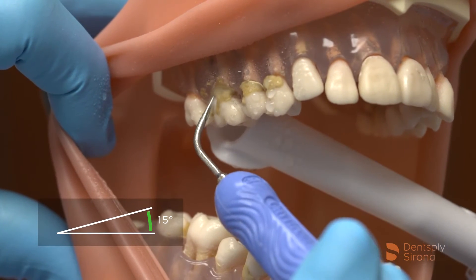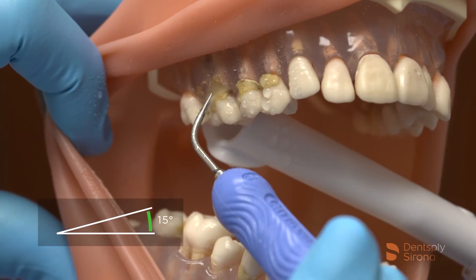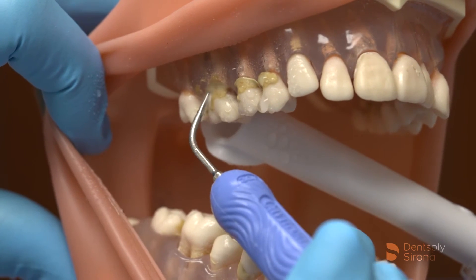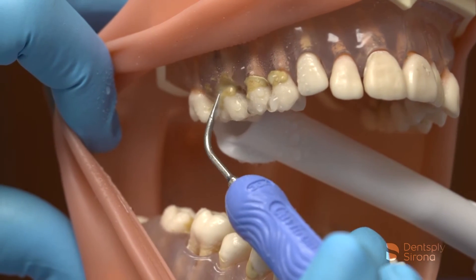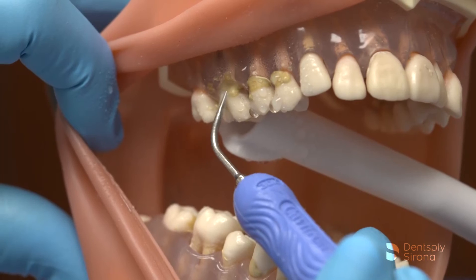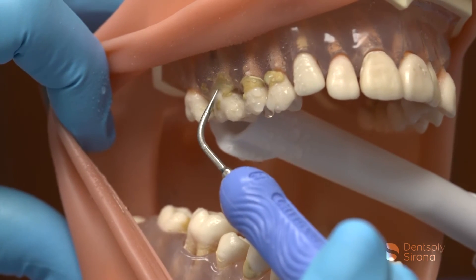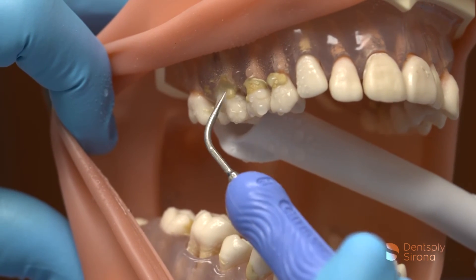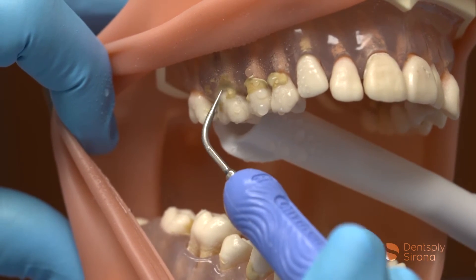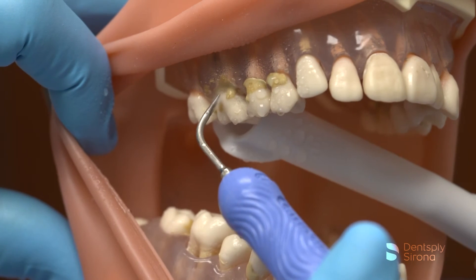When calculus is encountered, tap at the deposit in a multidirectional approach. Micro-fracturing the deposit and following with 2-3 mm sweeping strokes to flush the sulcus disrupts the biofilm and allows the clinician to assess the success of this technique.